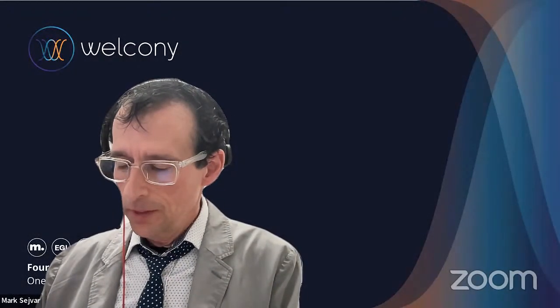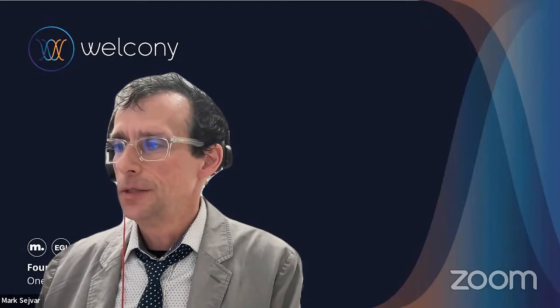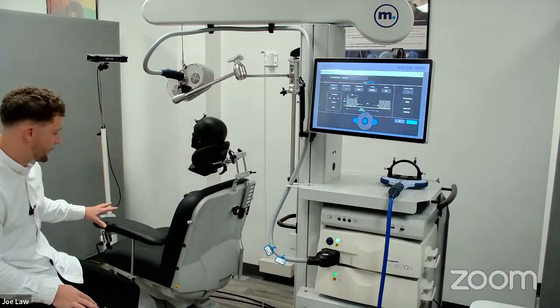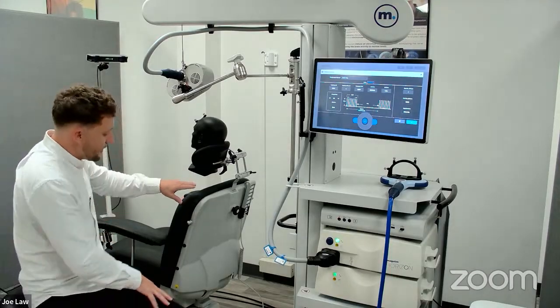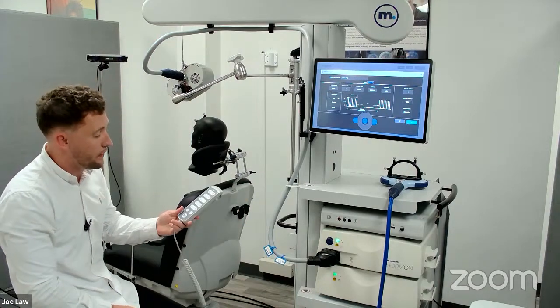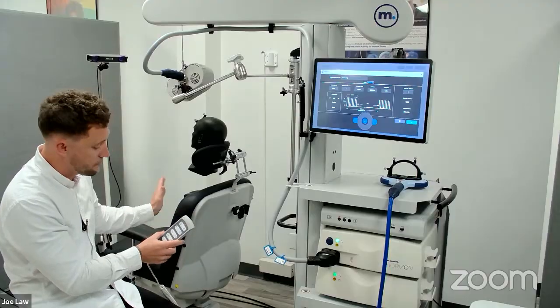Great. Tell me more about the chair and how the chair is adjusted. Sure, great question. The chair is fully motorized. We have a remote control back here, and on that we can do the height adjustment up and down, and a back adjustment up and down.